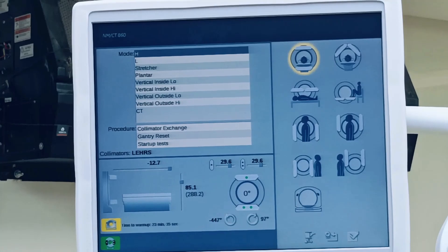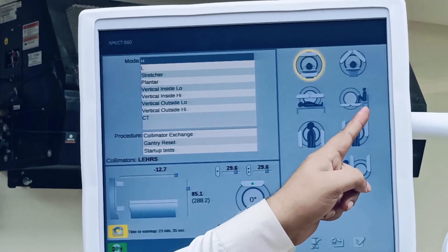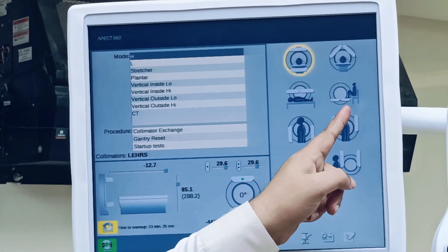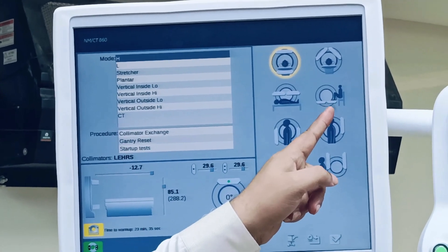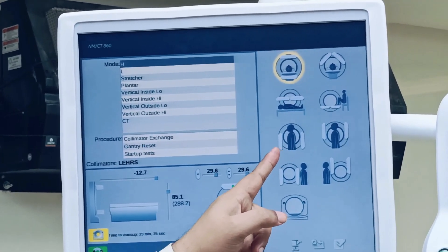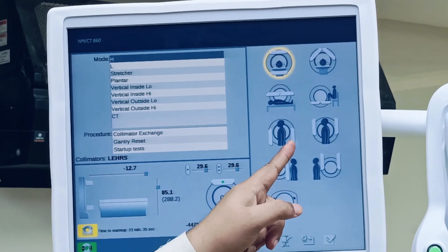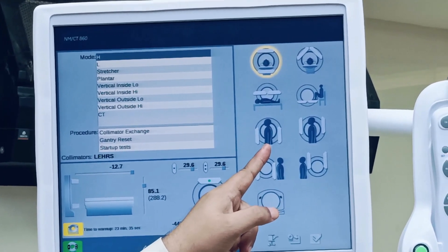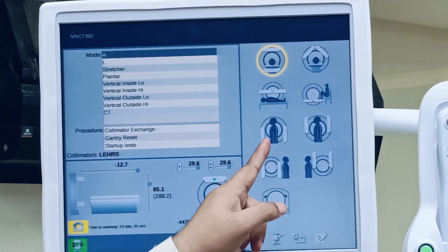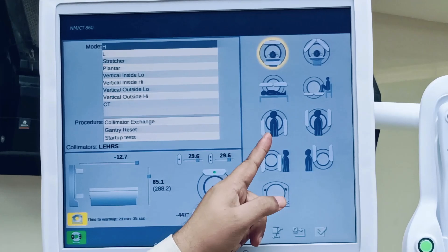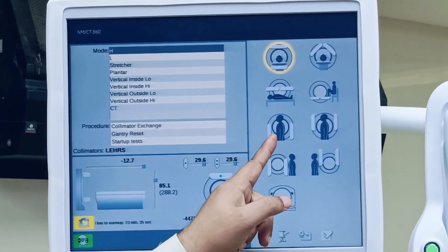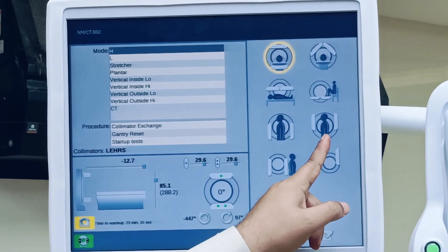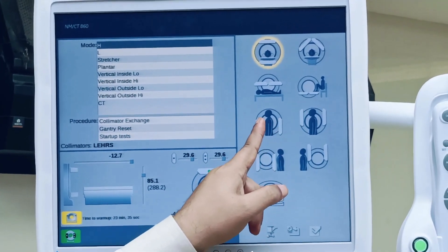This is the plantar view — if you want to take a picture of the sole of the patient's foot, you can make the patient sit on a chair and keep the legs directly on the detector. This is the vertical H mode, where the patient can stand in the middle of the two detectors to take anterior and posterior views in the standing position.